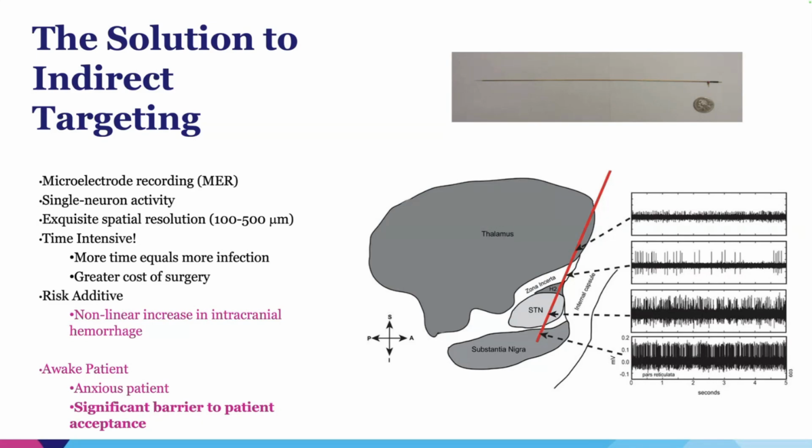But this was time intensive, and more time equals more infection, greater cost of surgery, arguably some additional risk, although it's not necessarily linear with how many passes you do. It did give exquisite spatial resolution, but again, it mandated an awake patient. And over almost 25 years of doing surgery, an awake patient ultimately is a more anxious patient, and awake surgery is a significant barrier to patient acceptance of a therapy that can really improve people's lives.